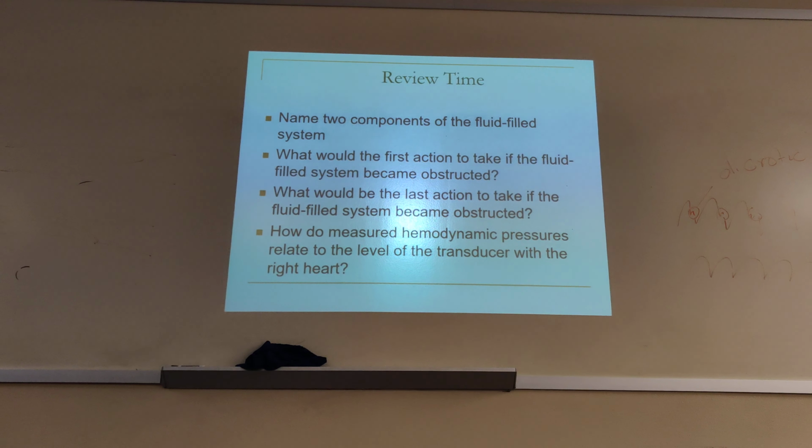How do measured hemodynamic pressures relate to the level of the transducer with the right heart? Again, if the transducer is placed way above the heart, that reduces hydrostatic pressure, and the hemodynamic pressure measured will be lower.